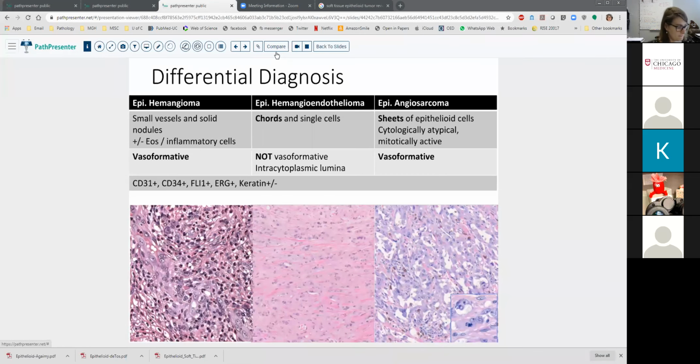Sometimes I get these confused with the spindle cell hemangioma. There's also the described Kaposiform hemangioendothelioma. When you get one of these, and you obviously don't want to call it angiosarcoma, if you misdiagnose it as a benign entity, spindle cell versus this entity, is it really a big difference? Management wise, I don't think it's going to matter, right? The most important thing is putting it in a benign hemangioma versus an indeterminate hemangioendothelioma.